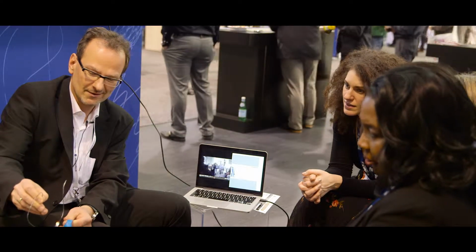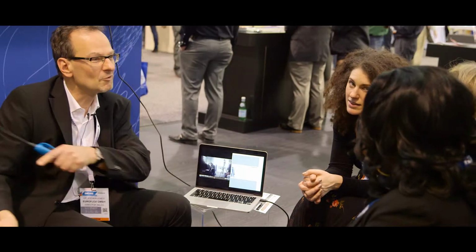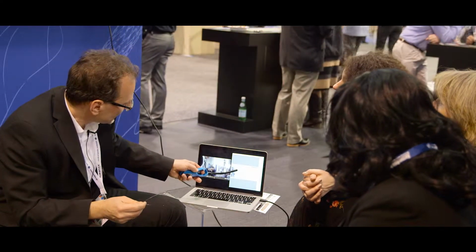Okay? In this case, the original shape was straight. But of course I can put any other shape in it, and if there's more interest in that, we can talk about it later, but just as a first step, any shape you give it, it will remember. In this version, by temperature. That's what's called the shape memory, or the thermal memory in this case, because it remembers the shape because I put temperature in it.